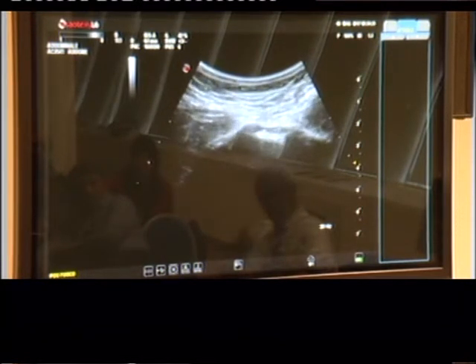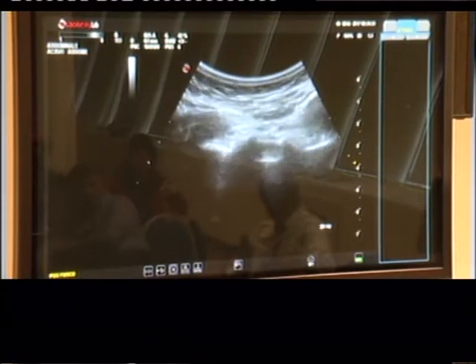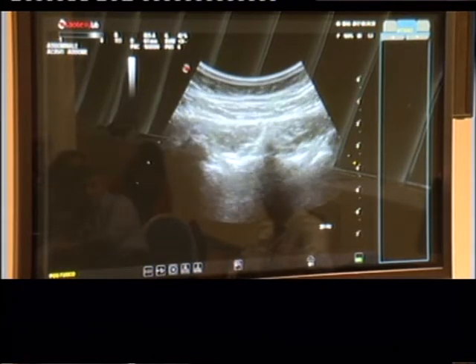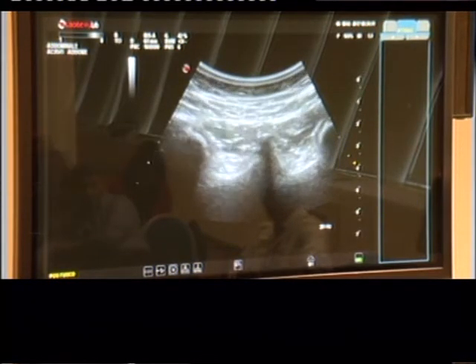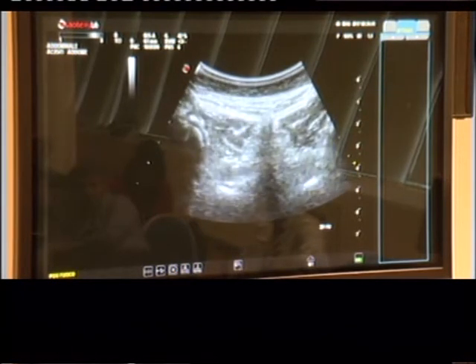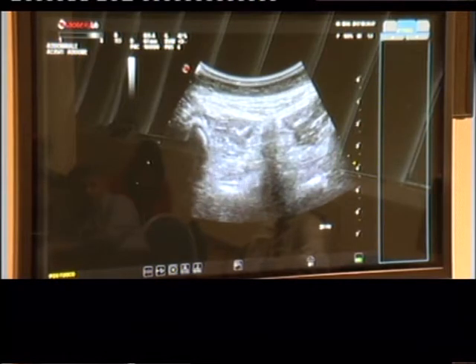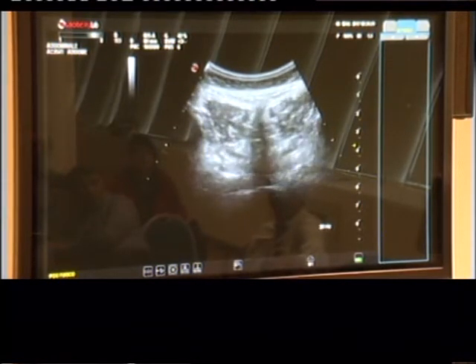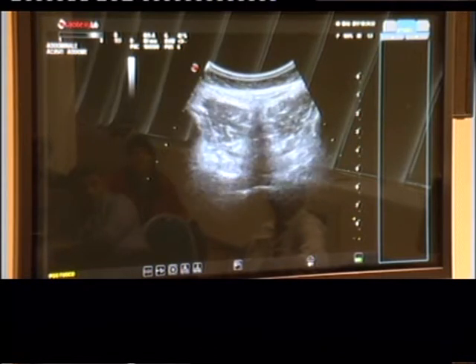So now my probe is almost straight, and now I'm going to go down, and you can see I'm going to keep going, and then can I have some more depth? More depth. Un po' più di profondità. And now, in a little more depth, there we go.